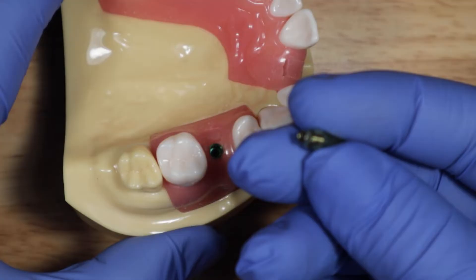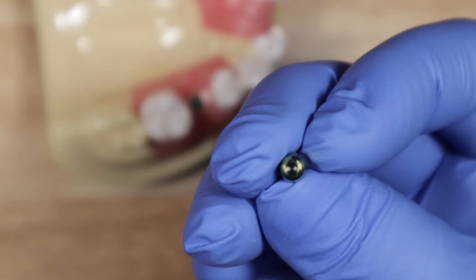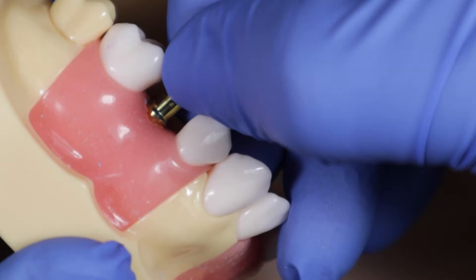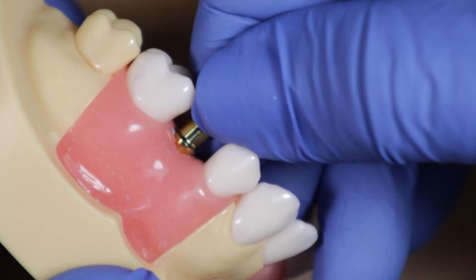Here's your implant. You're going to take your closed tray impression coping — it has a screw inside, so make sure that screw is still in there. Put this on the implant: rotate it and push until you feel it pop into place as the hex in the implant and the hex on the impression coping line up. You turn it and place it.